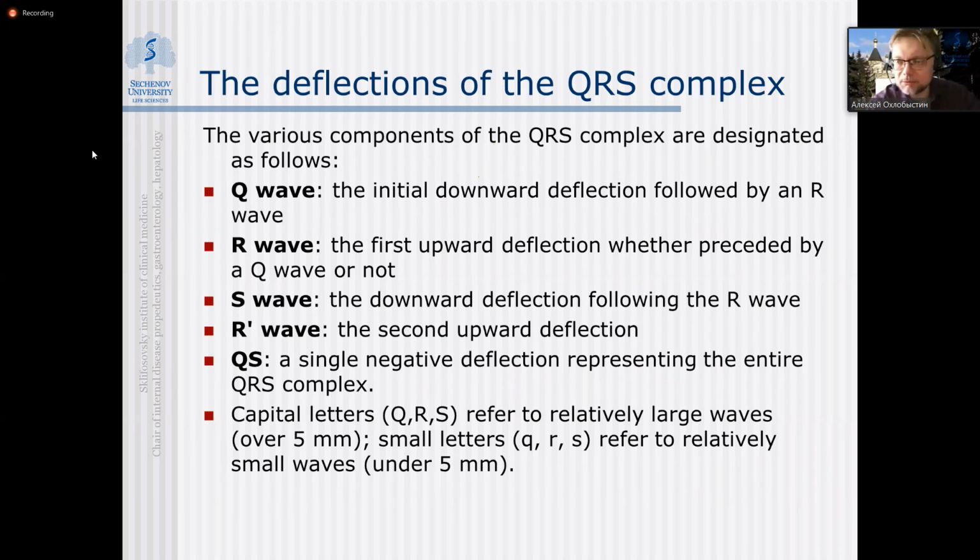Is it clear up to now? I'm afraid that if it was clear, now it will not be as clear, because we need to discuss some terminology from the point of view of deflections of the QRS complex.